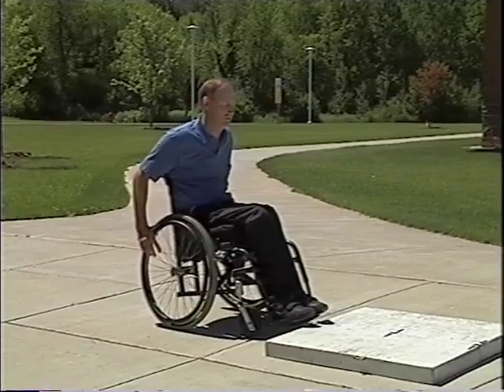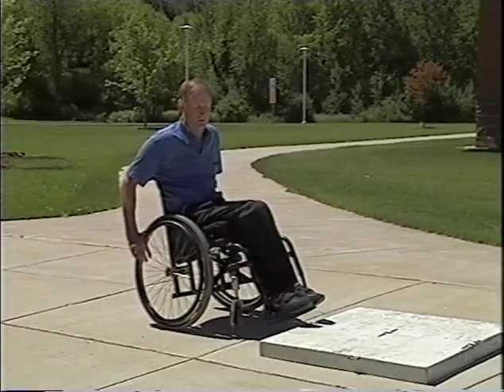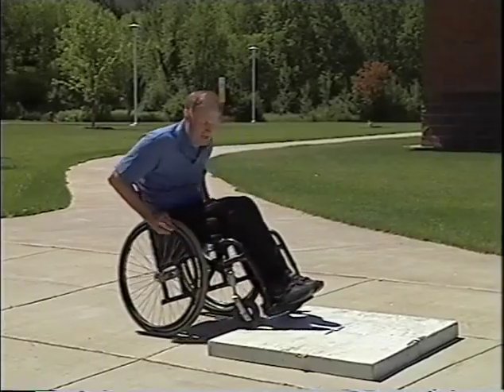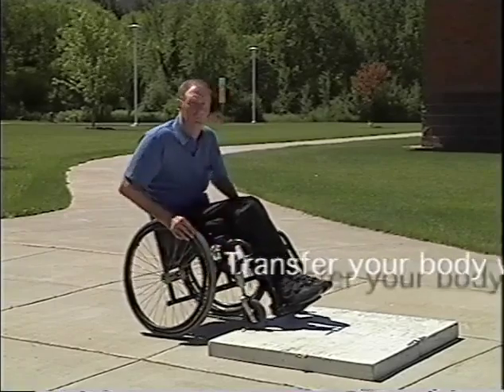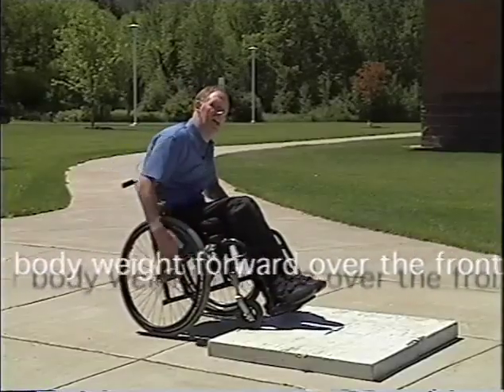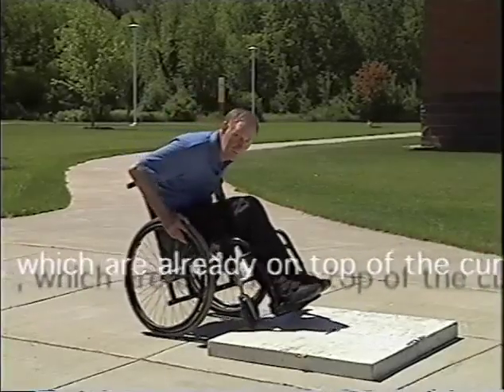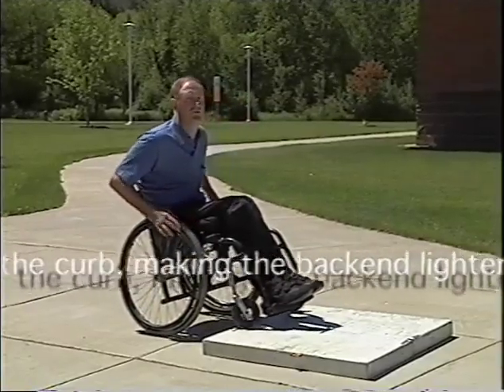All right, so you pull up to the curb. When you get fairly close, you can see the curb through your toes. Your hands are back. You're pulling your little wheelie. Put your wheels on the curb. Now spin them around and back up. And this is going to give you some running room to get your momentum moving before you hit this curb. And then your hands are in front of the axles and you're pushing your weight forward and then down. So when I fall forward, then push. So as soon as your body stops moving, that's when you should be starting to push.